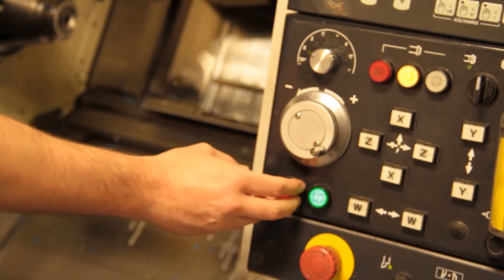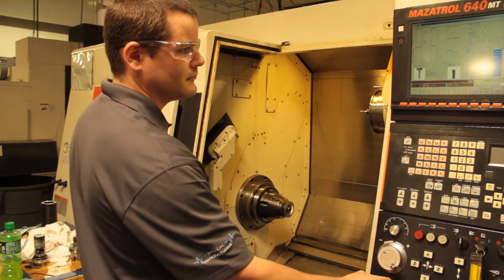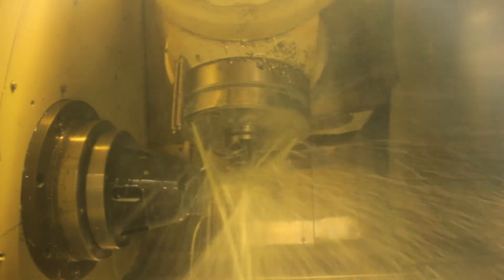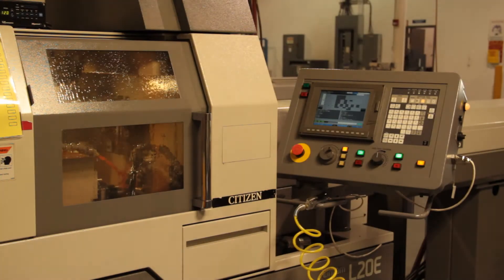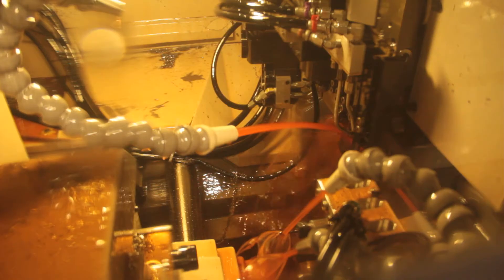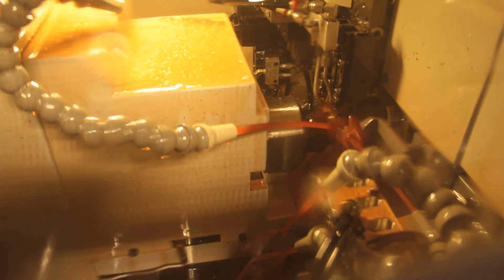Some parts we do are very complex. The machines are nine-axis machines — complex machines and complex parts — so it compounds how difficult the whole process is of making something, and then trying to make that process easy for the operator to understand. As technology changes and advances, a lot of customers know what they need, and things can be made now that couldn't be made several years ago.